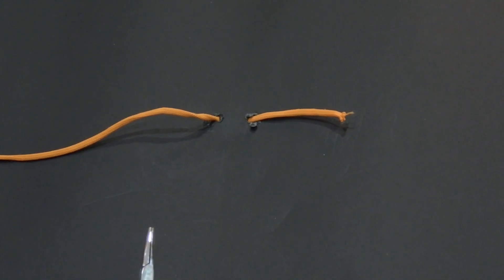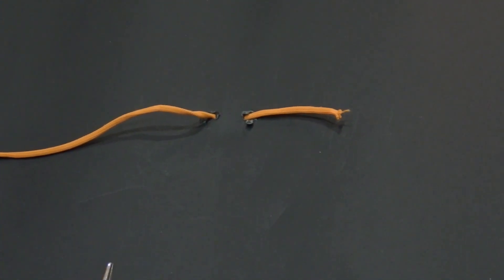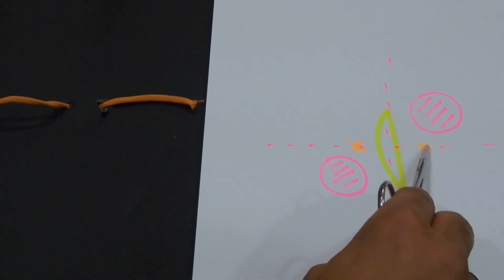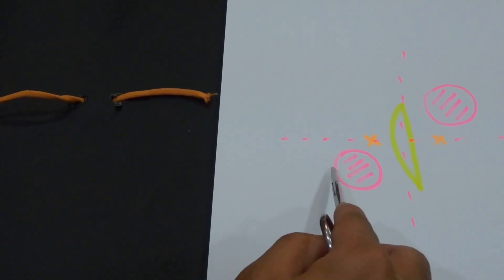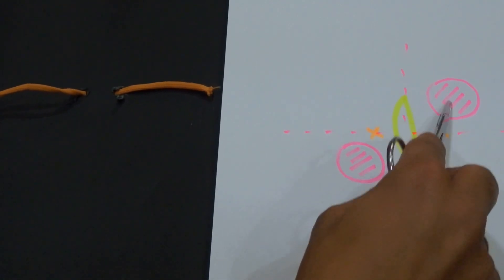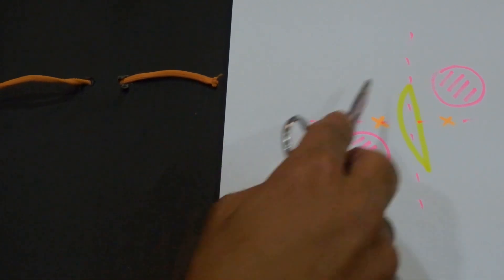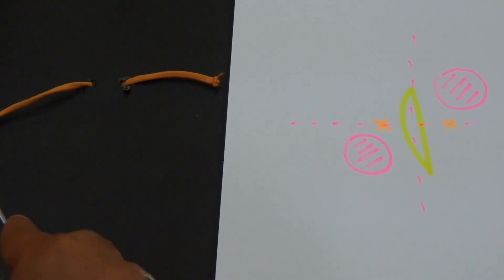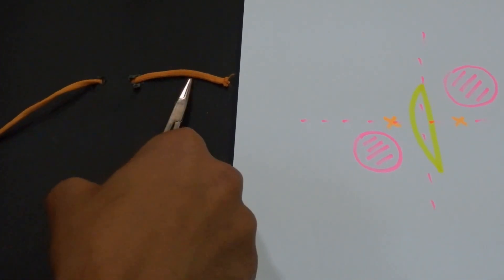Now let's apply the first principle, which is changing the direction to make it a square knot. Let's consider this is the incision — I have entered from the right side toward the left side and have divided. So our target is either this corner or that corner for the free end. I have to bring this free end either to this corner or toward that corner.